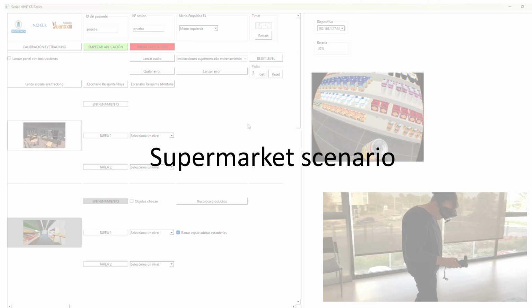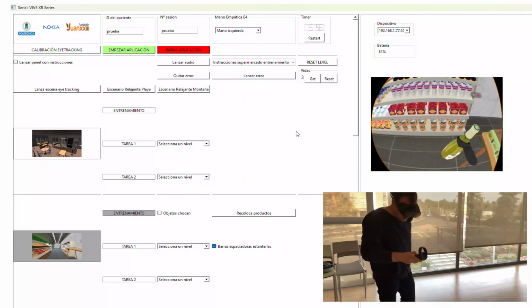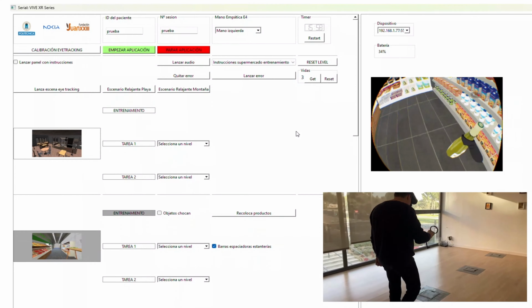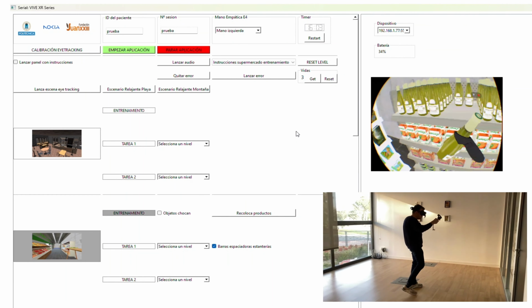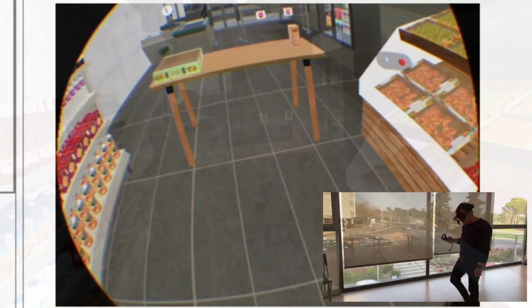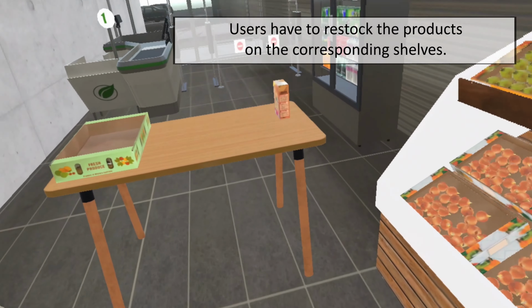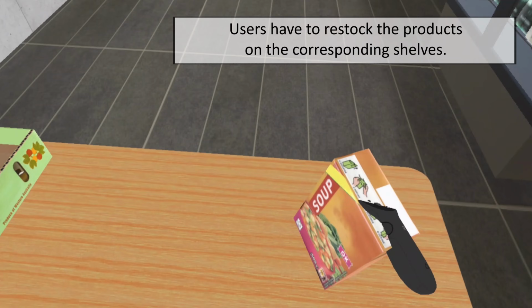We continue with cognitive task training. Firstly, we show a demo of the supermarket scenario. The therapist can launch the scenario and level from the interface and can track in real time how the user is performing the task. In this demo, the user is performing the first task, which is to restock products to shelves.